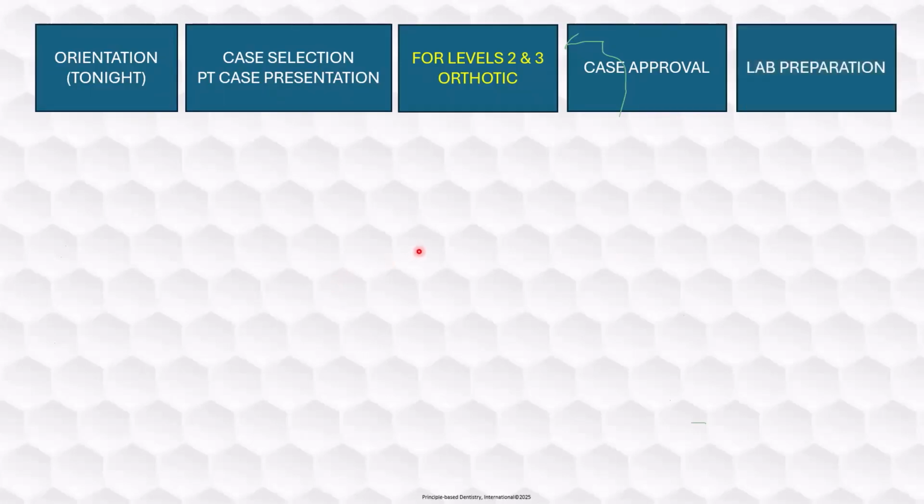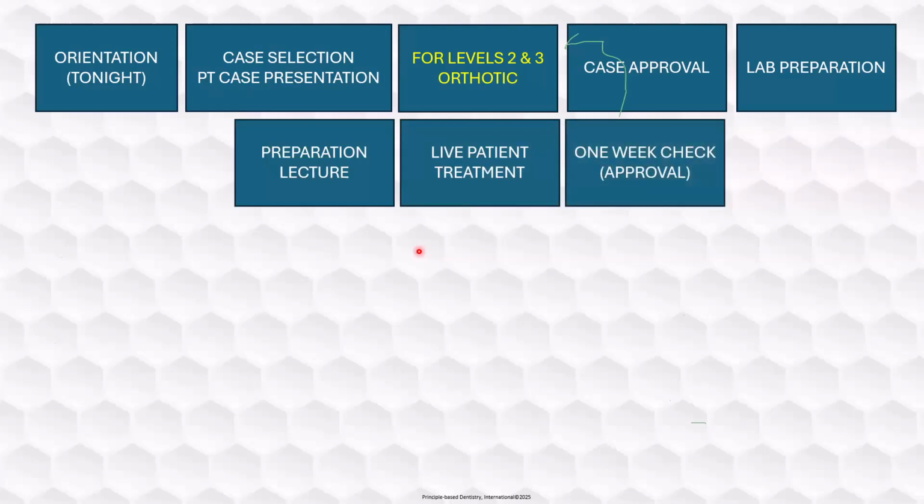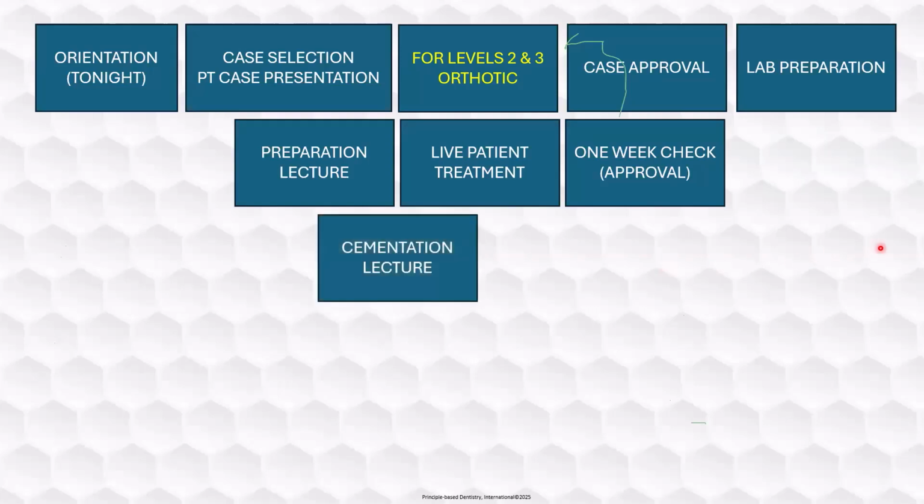And then what we do is we send that case to the lab to have all the workup done. Then the first session, the sessions will run 2 days. The prep weekend, we have day 1, which is a lecture about what we're going to do when we get into the clinic. And then day 2 of that session, we do the live patient treatment. What I recommend the doctors do, after we get the temporaries in the patient's mouth, is get the patient back a week later just to be sure that they like the way everything looks, they like the way everything feels, and kind of get the patient's approval to move on.